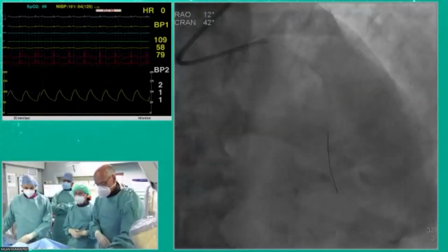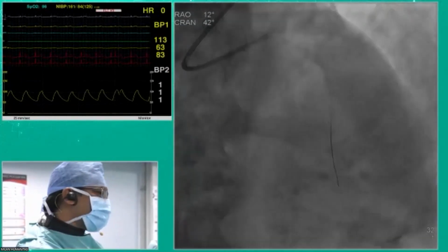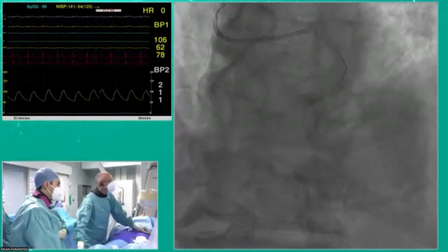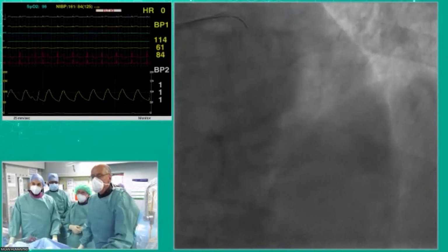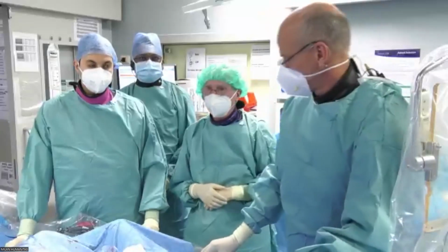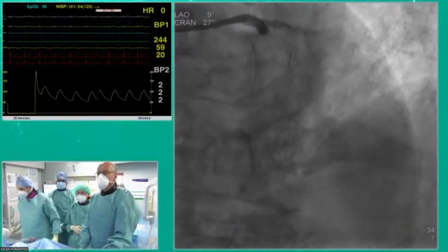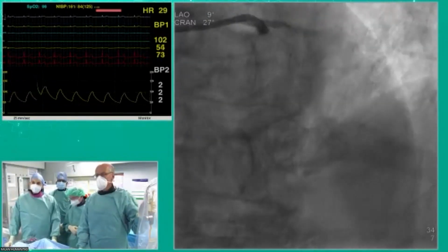Antonio, I have a question for you. After you saw the IVUS of what the calcium looked like, if you went back, I didn't see the beginning, but would you have rotablated the whole thing, or do you think a balloon-based strategy would work? No, we rotablated also that area. The problem is that if you really wanted to do it, we should have taken a 1.75 burr for the proximal part. Got it. Because it's really small. I think it's okay. This is a great result. It looks like a fantastic result.